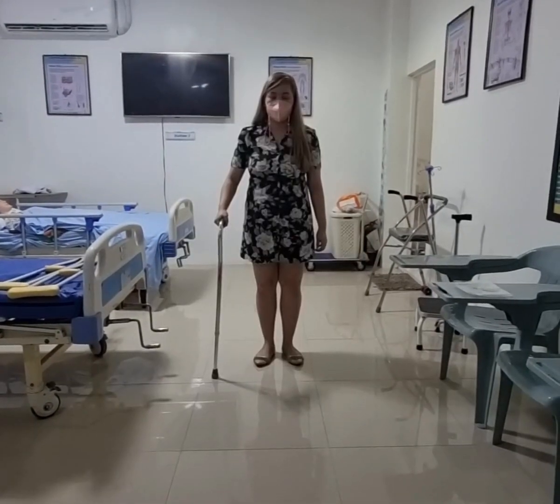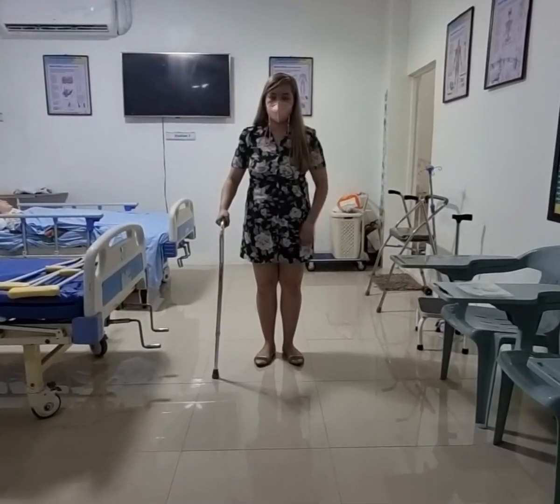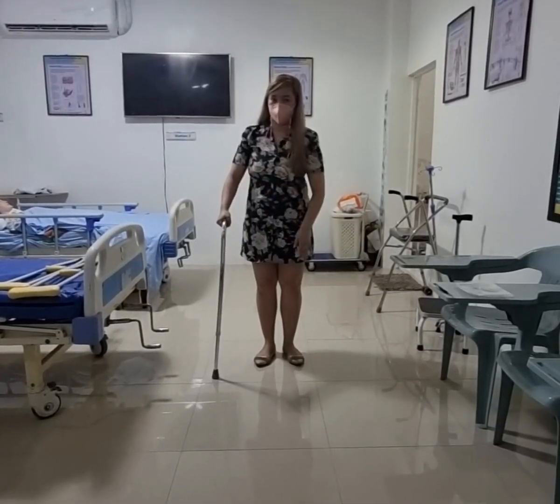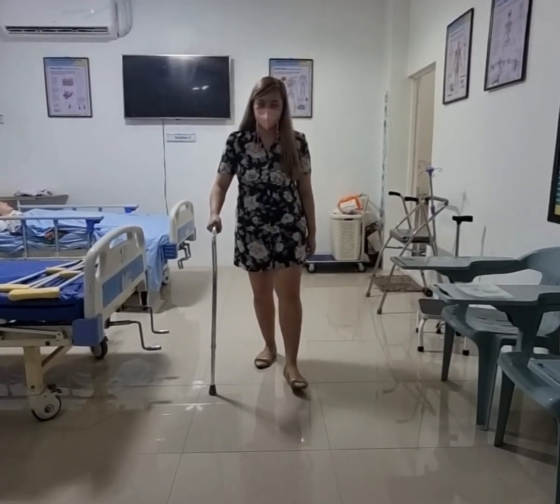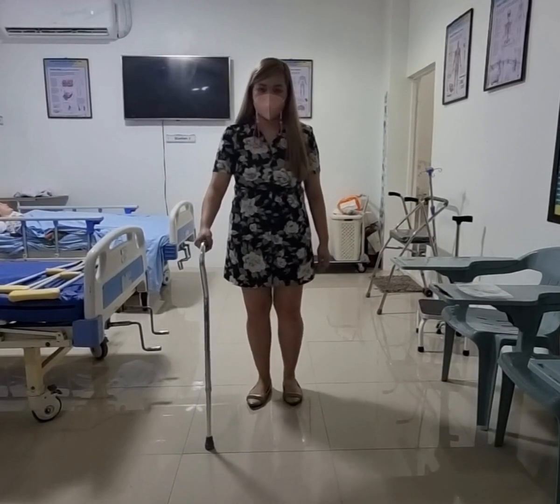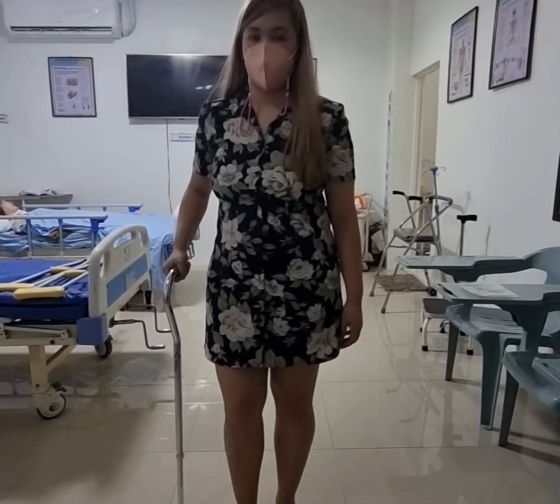Ang cane po dapat lagi nasa opposite side. Again, ulitin natin. Dapat yung elbow mo medyo bend. Ito po yung bad leg ko and then good leg ko. Cane, bad leg, good leg.